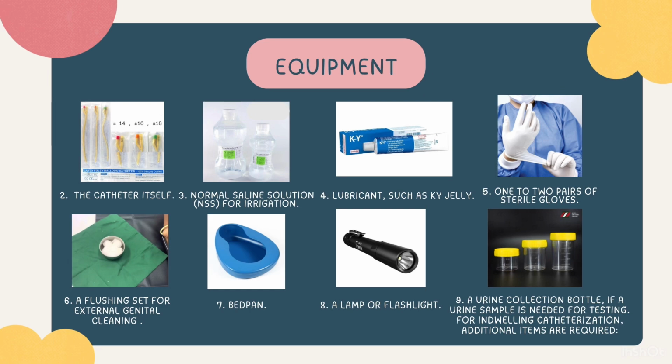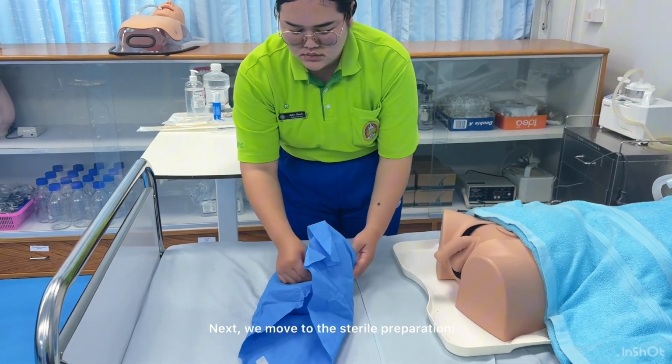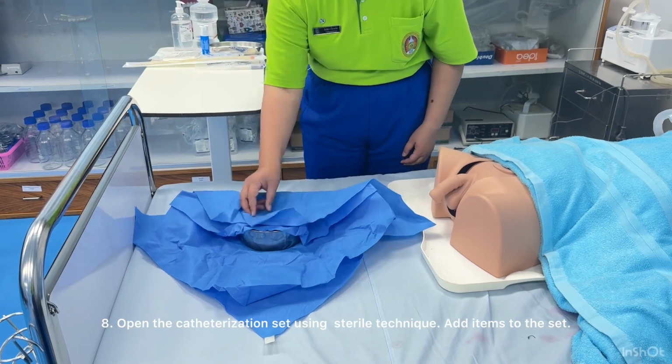For indwelling catheterization, additional items are required. A urine bag, a sterile syringe, sterile distilled water, plaster. Next, we move to the sterile preparation. Step 8. Open the catheterization set using sterile technique. Add items to the set.